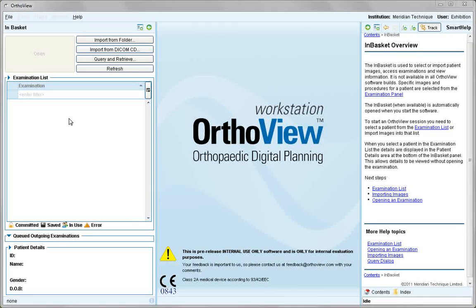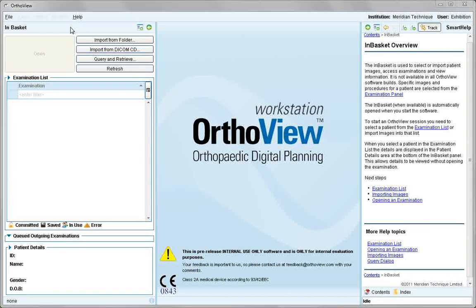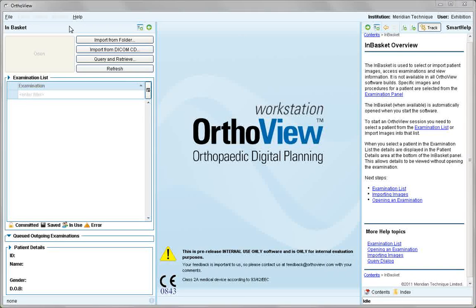If we start with images, they can be acquired via the in-basket, which will be discussed in detail in another video tutorial, or will be launched directly into OrthoView if you are using an integrated system within your PACS.